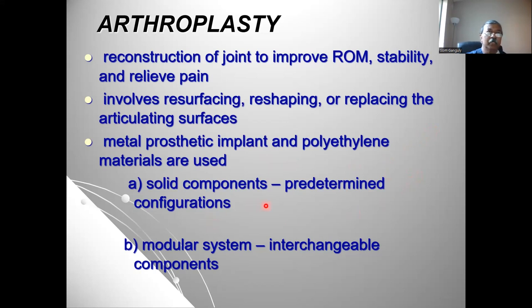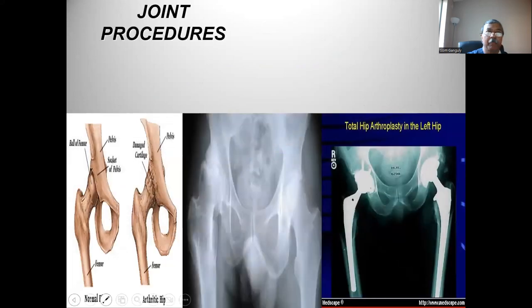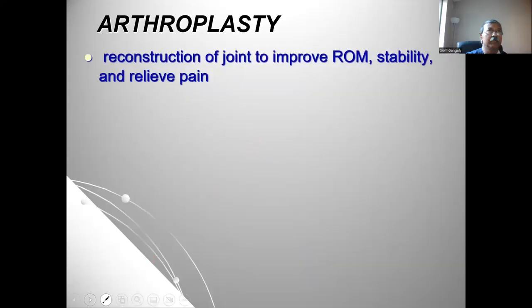A solid component, which is one stem, like the one that you have seen in this previous illustration here, versus multiple components, can be utilized in order to have a total hip arthroplasty surgery.